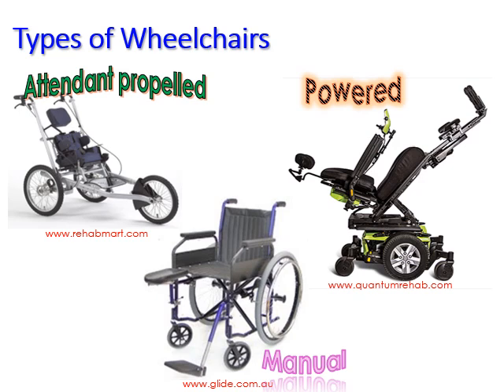If you've gone to the airport recently, you might have seen the specialized aisle wheelchairs, which allow somebody to fit into a plane while somebody else propels them. There are also specialized strollers that are attendant propelled. They are actually wheelchairs, but designed as strollers to push a child or an adult who's better seated in a stroller type of chair.